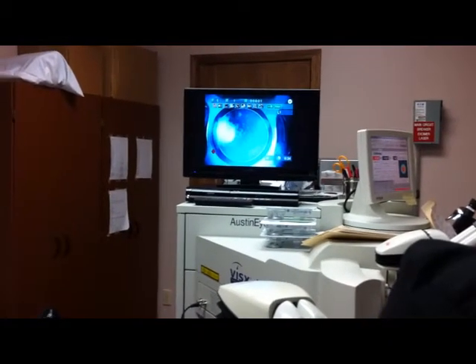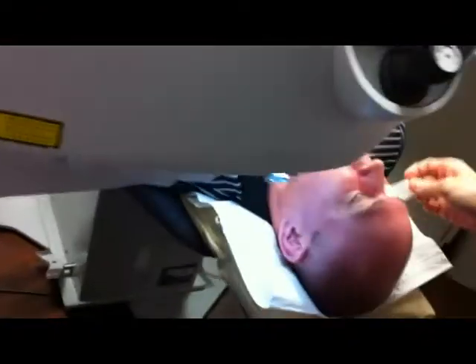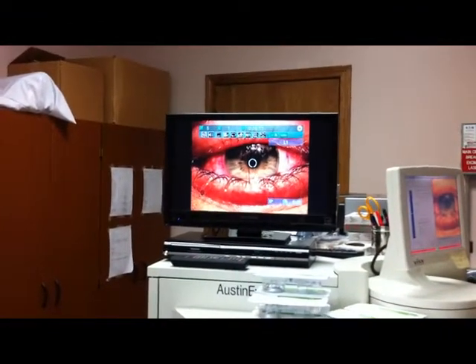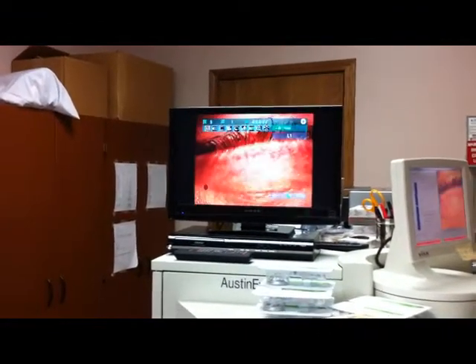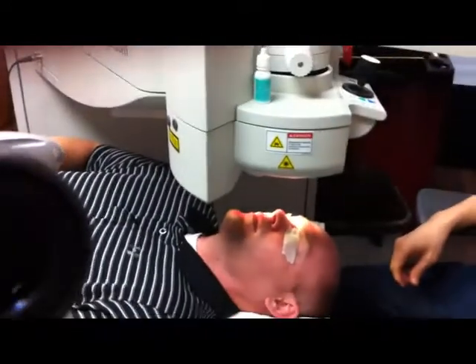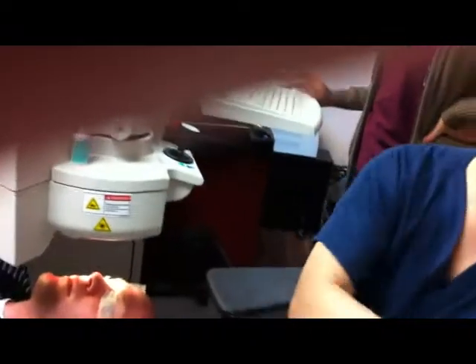Five seconds remaining. Procedure complete. Good. Lift everything away. Perfect. That looks great. All right, I'm going to place a patch over your left eye, Jason. Close gently. Let's see, the treatment says 4.34, and I added one.